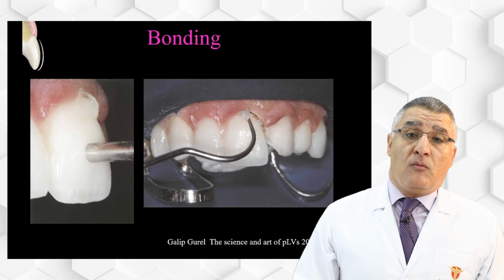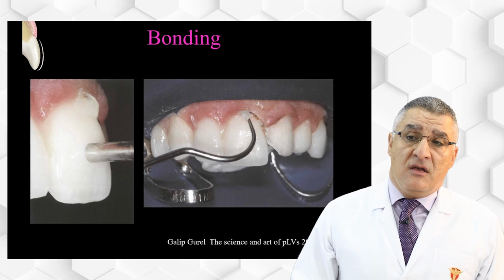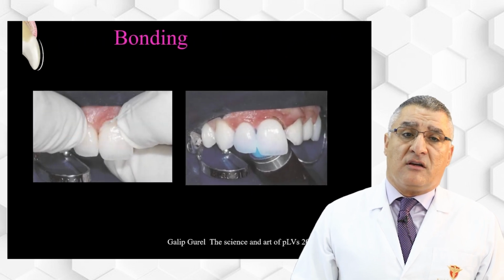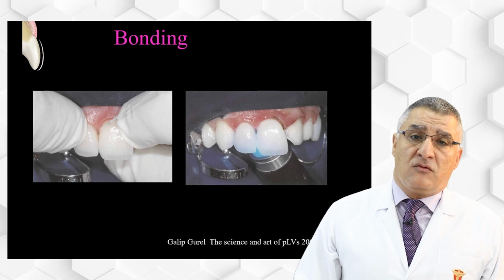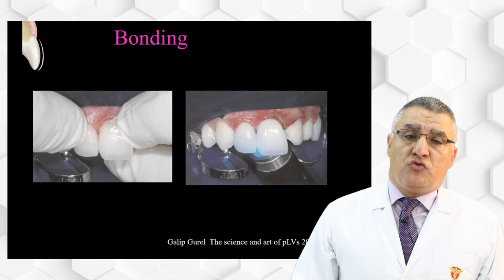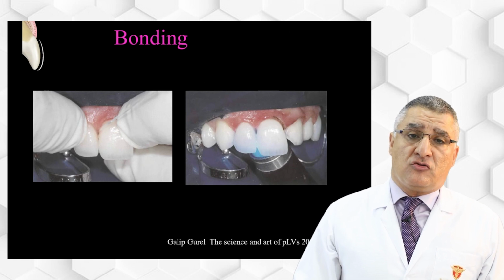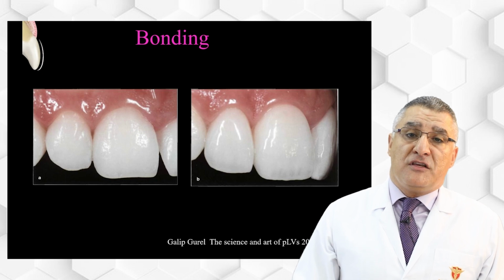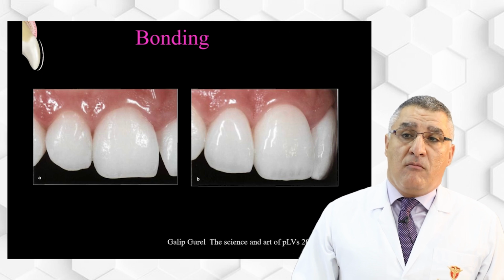After tack cure, start to remove all of the excess cement. Then once you remove all the excess cement, you can make a complete curing. Start the curing on the palatal surface, then the labial and incisal surface. After that, you should use dental floss to remove all of the excess cement. And after removing all of the excess, you have to finish and remove any sharp part from the bonding agent. You can use a scalpel or finishing burs, and this will be the shape after final bonding.